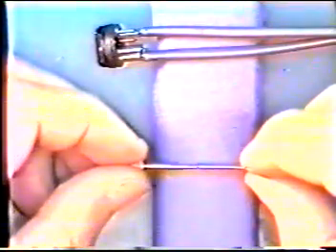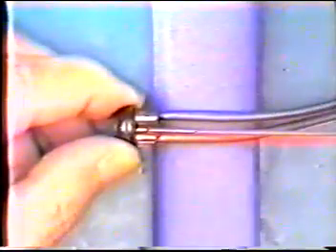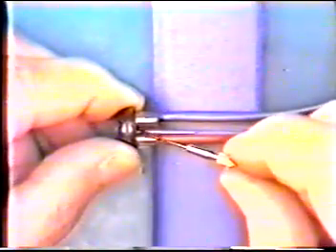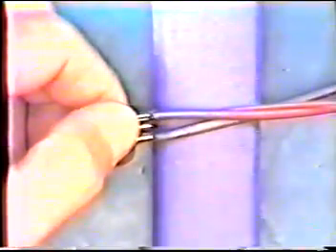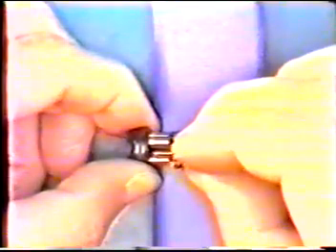Attach WJT. Prior to attachment, sleeve should be cleaned and inlet of WJT should be widened a little bit. Insert WJT halfway and apply araldite. After application, WJT should be rotated so that araldite may be spread thoroughly. Hold WJT with a piece of sandpaper and insert it to full extent. Apply araldite again on WJT.